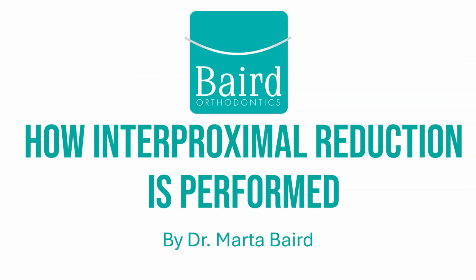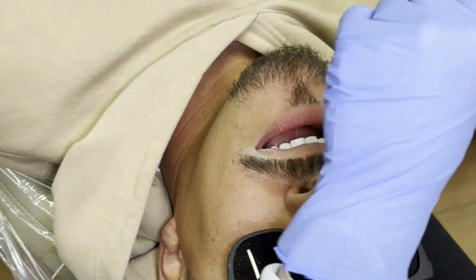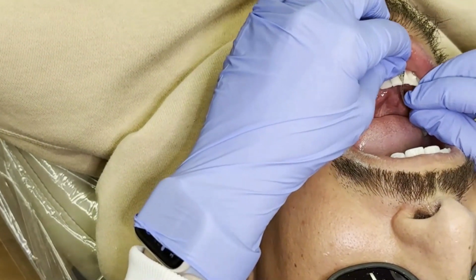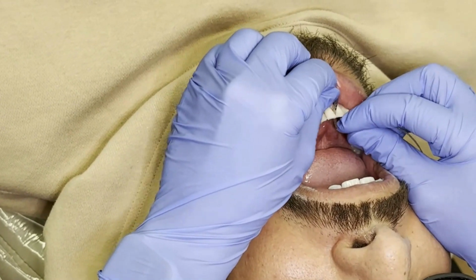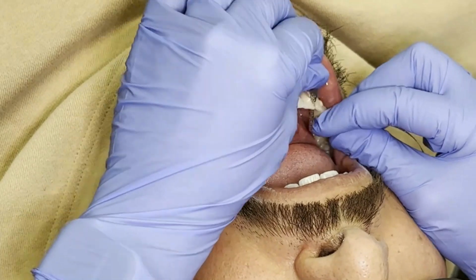How is interproximal reduction performed? Well, here's a video of me performing interproximal reduction on one of my patients. I use a very fine file that's about the thickness of a piece of paper, and I gradually polish in between each tooth.